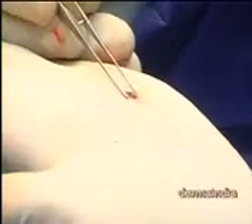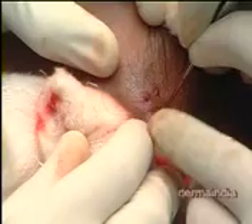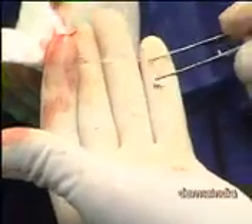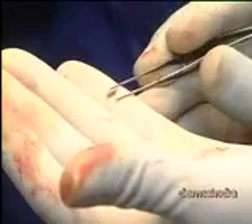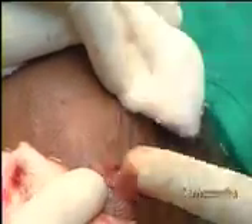Just catch it like that, go inside and implant it. This will be very easy. Don't think about strip graft, don't think about other things. This will be very easy and the trauma is very very minimal.